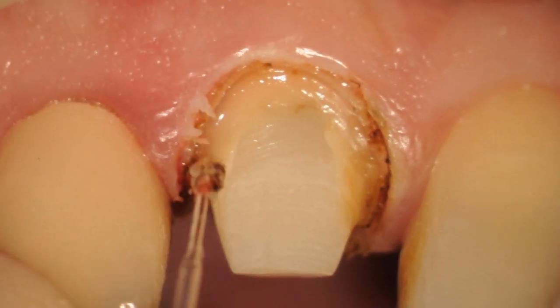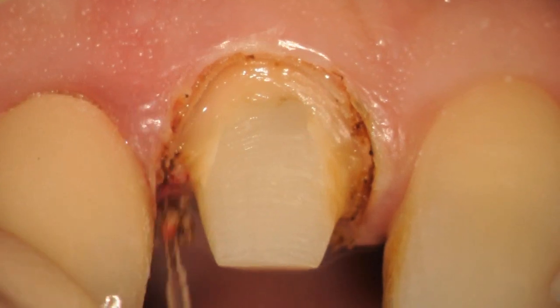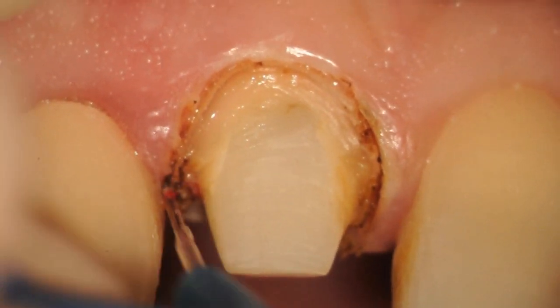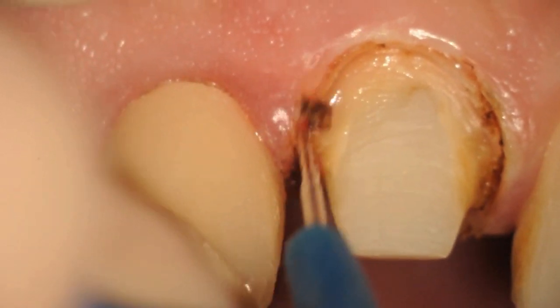You can see the angulation that is used. In this case, the Picasso light disposable tips — a 90-degree tip, 10 millimeters long — were used to create this trough around the tooth.